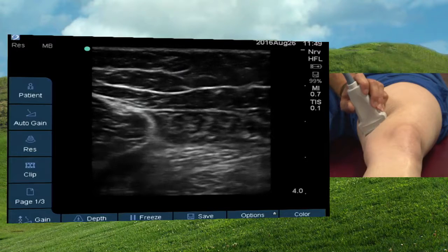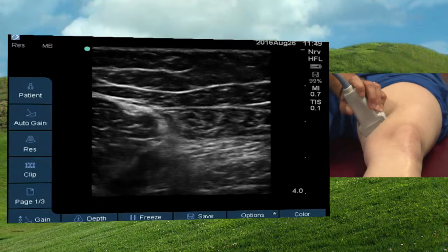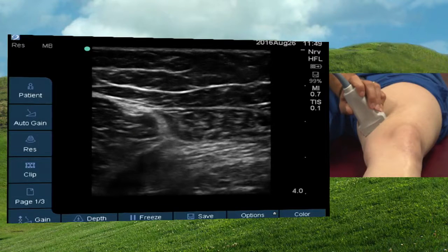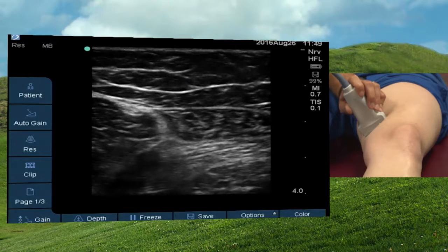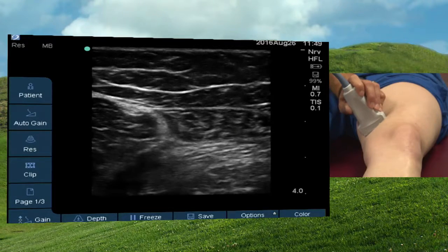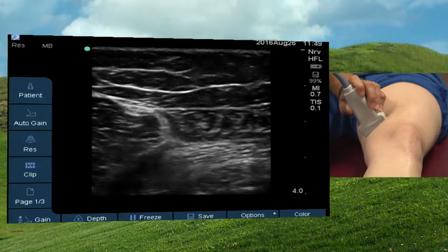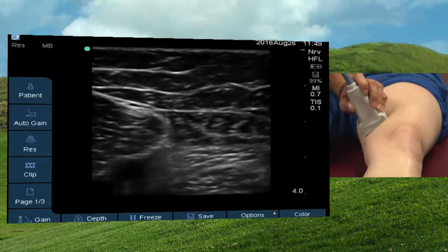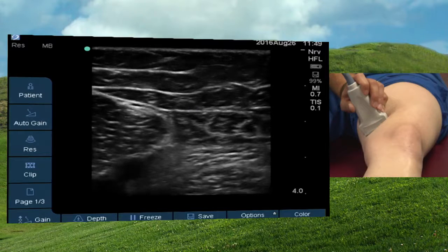We do them on occasion. They're useful for much more than total knee because this nerve goes on to be the saphenous nerve. They're actually quite useful if you need some analgesia to the ankle over the medial malleolus, and that's one way to tell that you've had a successful block: you'll have analgesia over the anterior aspect of the tibia and over the medial malleolus. If we were to follow this all the way up, we could follow the artery and it would go up to the inguinal area and into the femoral triangle where we would put a femoral nerve block.